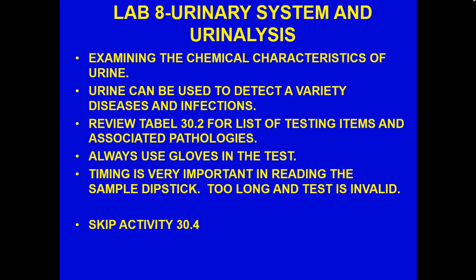Now, here's part of what I'm trying to emphasize. If you wait too long, the chemical reactions continue and you get an error in your reading. And that could be serious, especially if you're trying to make a determination of whether someone has certain pathologies of either the kidneys or of the blood, etc. Okay?